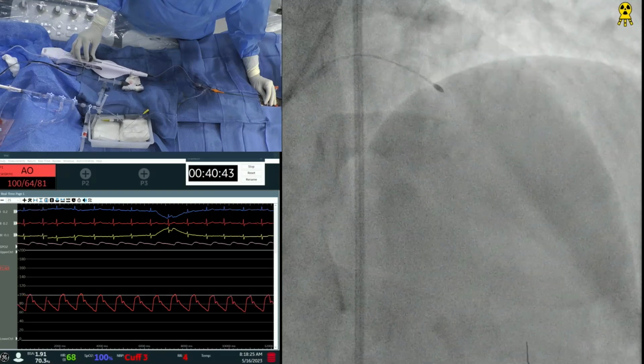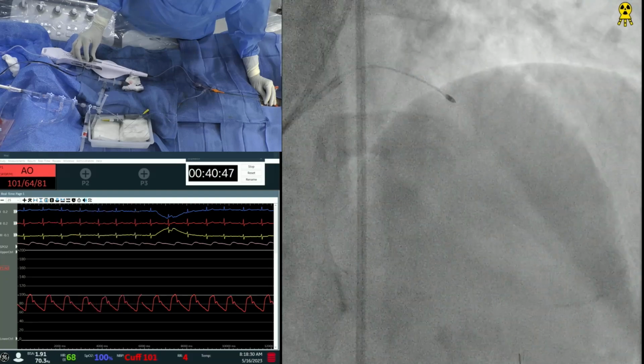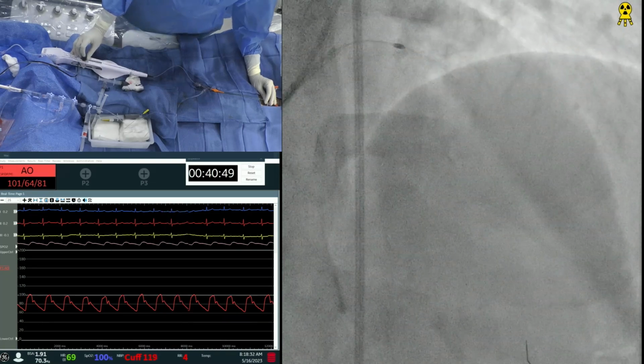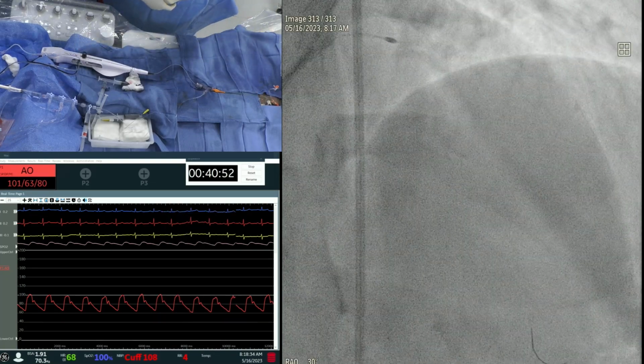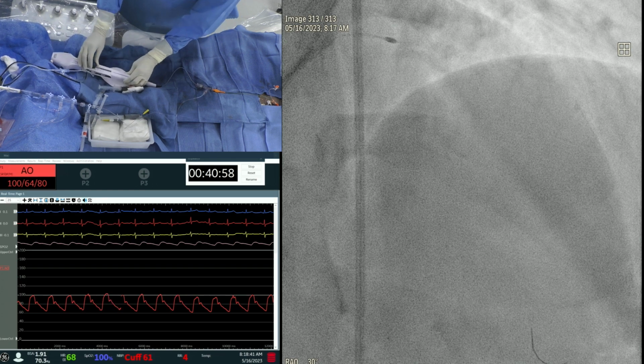Well, almost sensing your reply, another question has come. Is IVL on the cards here? No, IVL as a supplementary adjunct, no, IVL won't make a turn. We know that IVL, I'm sure they're talking about it as supplementary to rotatripsy. Oh, 100%, yes.